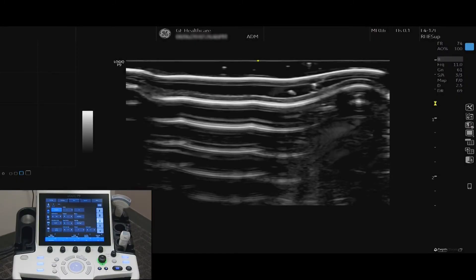Compare Assistant is a feature that will allow you to perform serial scans on a patient and compare their images side by side. All image settings, body patterns, and comments are transferred from the previous exam to the current exam.